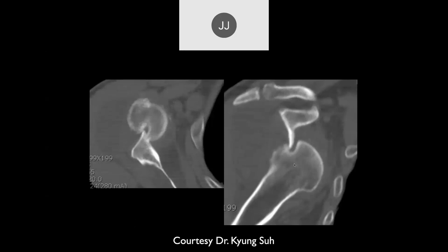On CT you can see the same thing: the anterior dislocation, the glenoid banging against the posterior superior humeral head, producing the classic Hill-Sachs lesion. You can also fracture the glenoid, which is the classic bony Bankart that we'll be talking about.